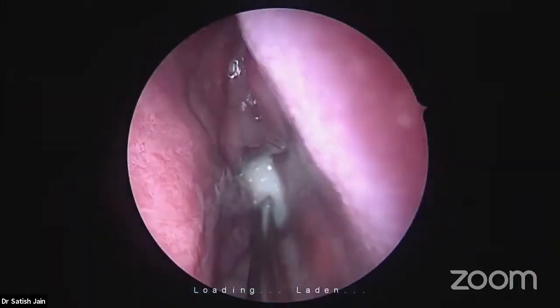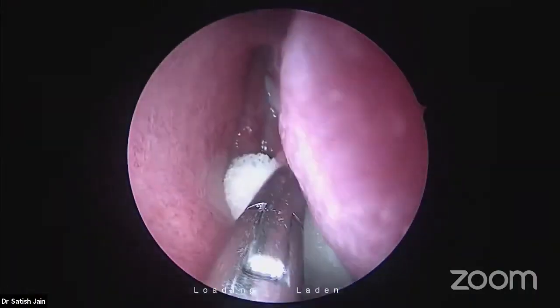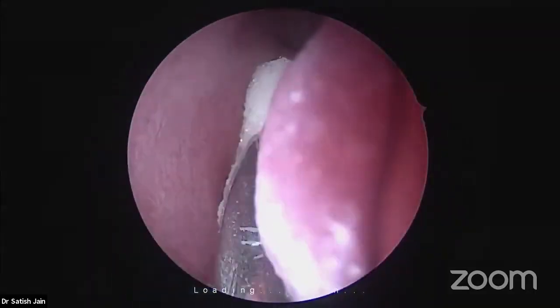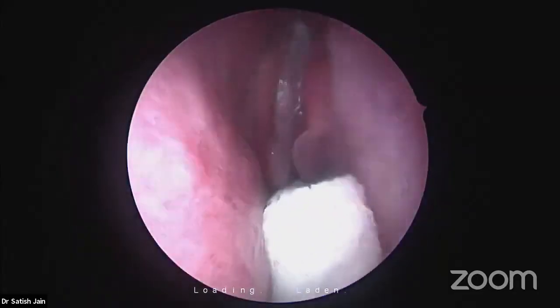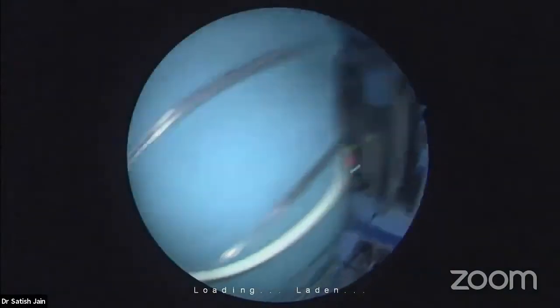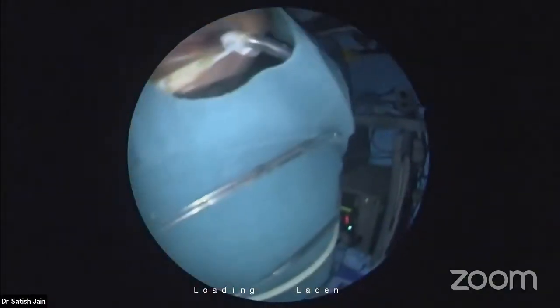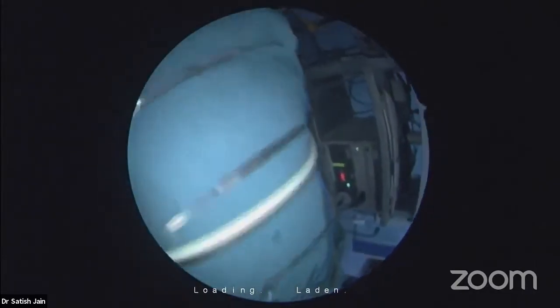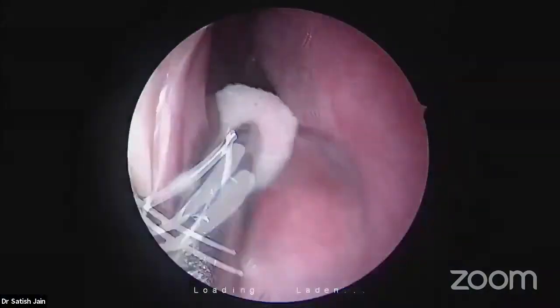Now coming to your point of local anesthesia. Number one, why it was introduced earlier. Local anesthesia gives you great feedback. If you cross the limits of the sinus cavity and approach an adjacent area like the skull base or orbit, whatever good anesthesia you have given, the patient will invariably experience pain. And that is amazing feedback to the surgeon that you are crossing the limits. So that is the value of local anesthesia, how it was introduced.